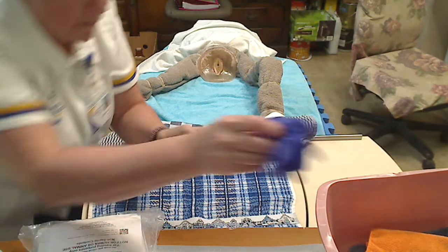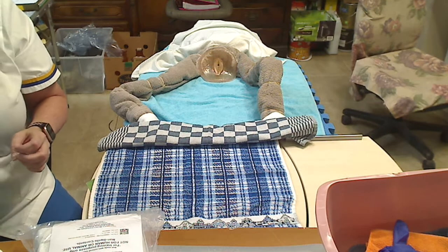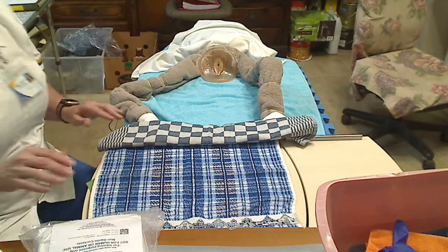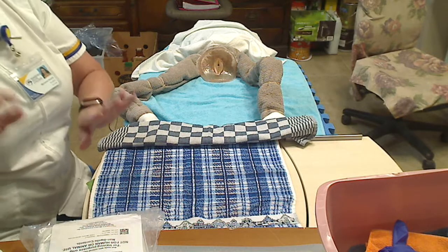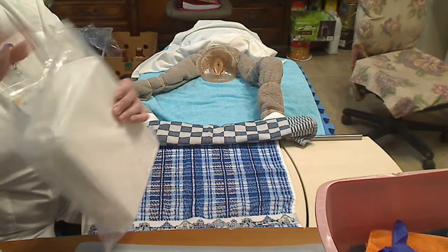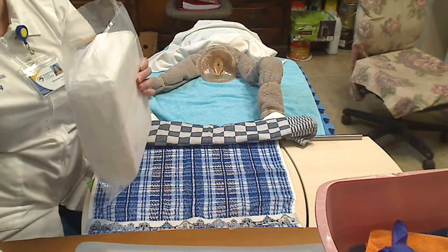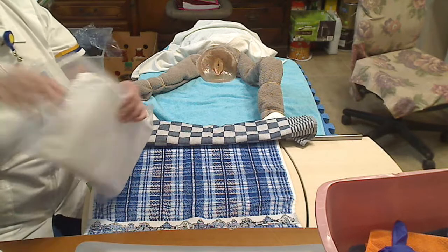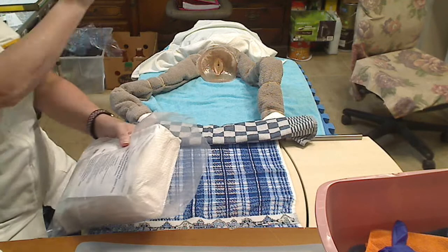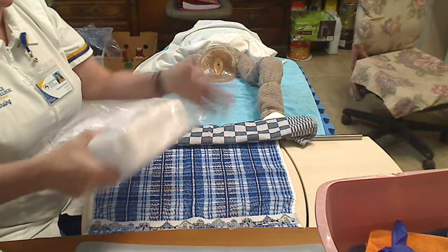All right. The next part of the procedure is going to be a sterile procedure. So I need to make sure that I use my sterile techniques. The bag, when I open it up, I will utilize the bag as a garbage can, or I can utilize the can that is just right below me. I'm going to use it to the right side of me so that I don't cross-contaminate by crossing over my arms. So I'm going to keep it down and to the right.